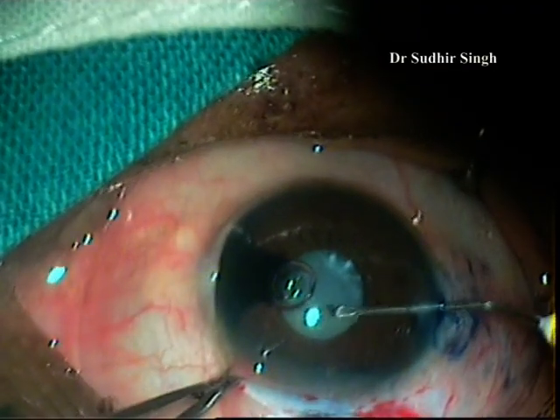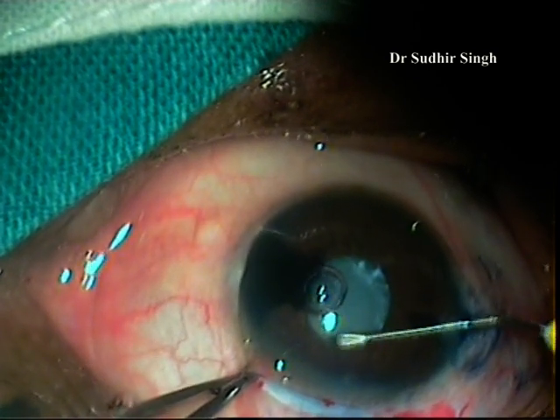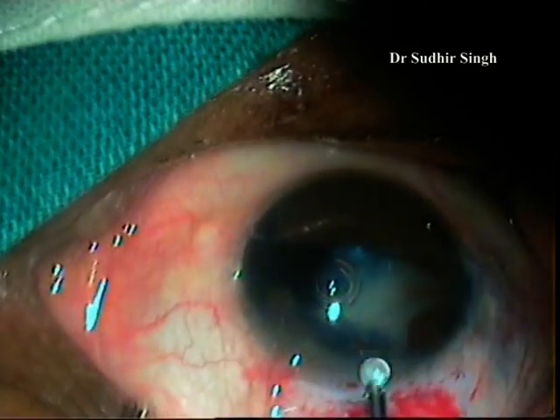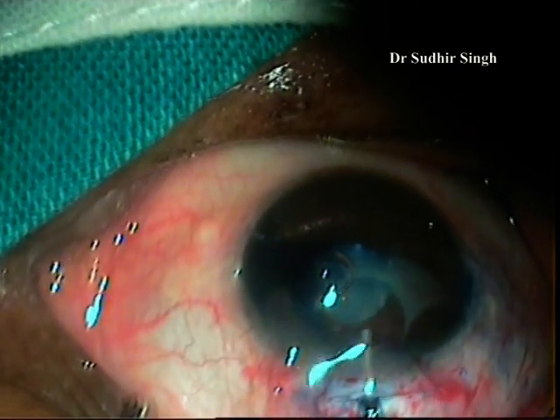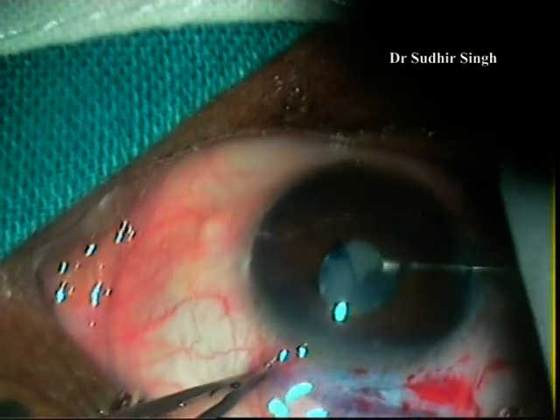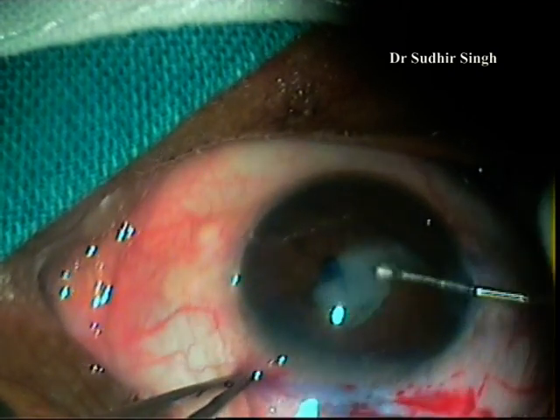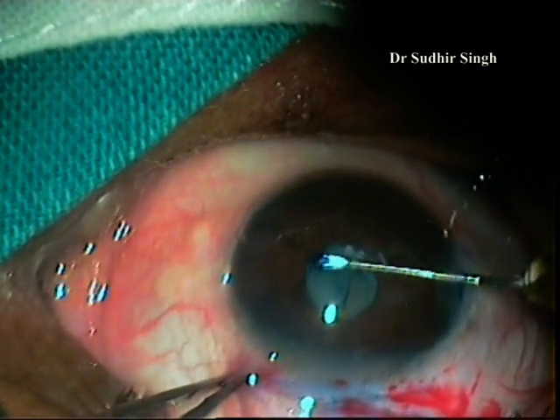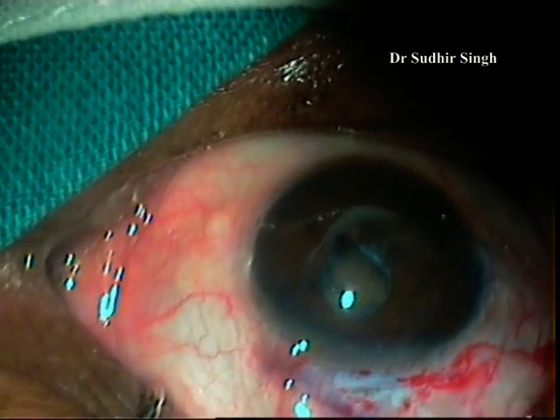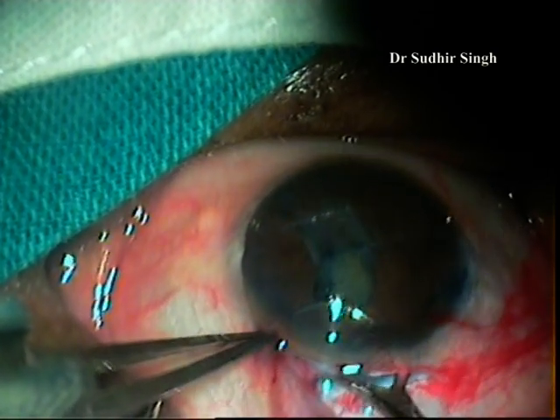This is a white Morganian cataract with calcified and fibrous lens capsule and poor zonular support. The pupil size is about four millimeters. Capsulorhexis is risky in this situation as chances of zonular dialysis are more, so a safer can opener capsulotomy is opted for. Multiple puncture four millimeters can opener capsulotomy is done. After initial punctures, milky liquefied cortical matter came out into the anterior chamber and was flushed outside by injecting viscoelastics.